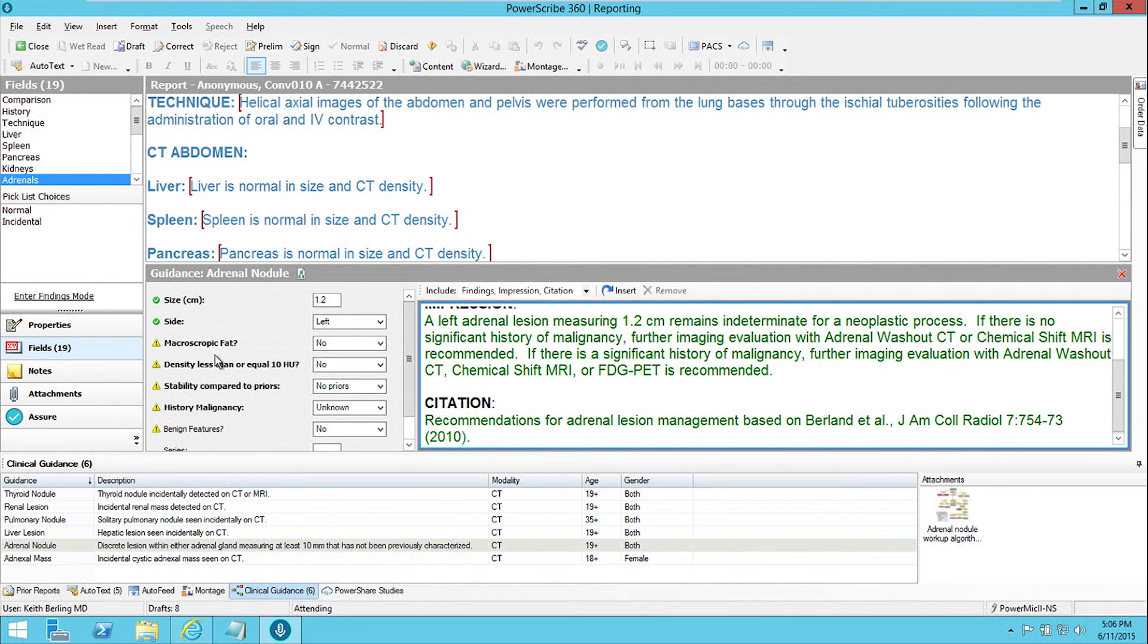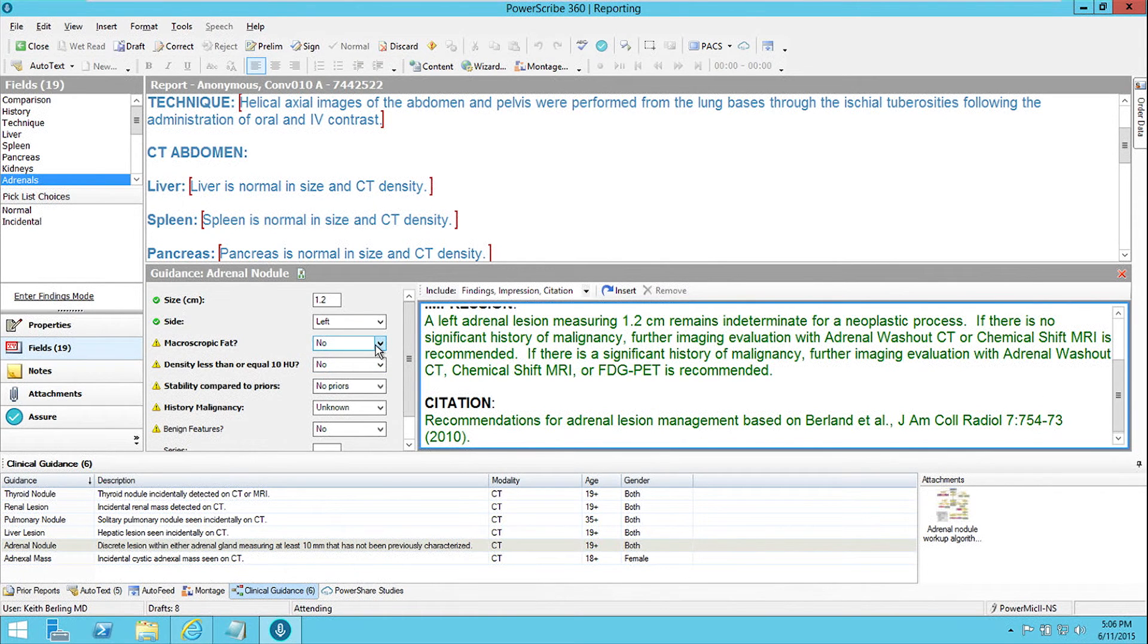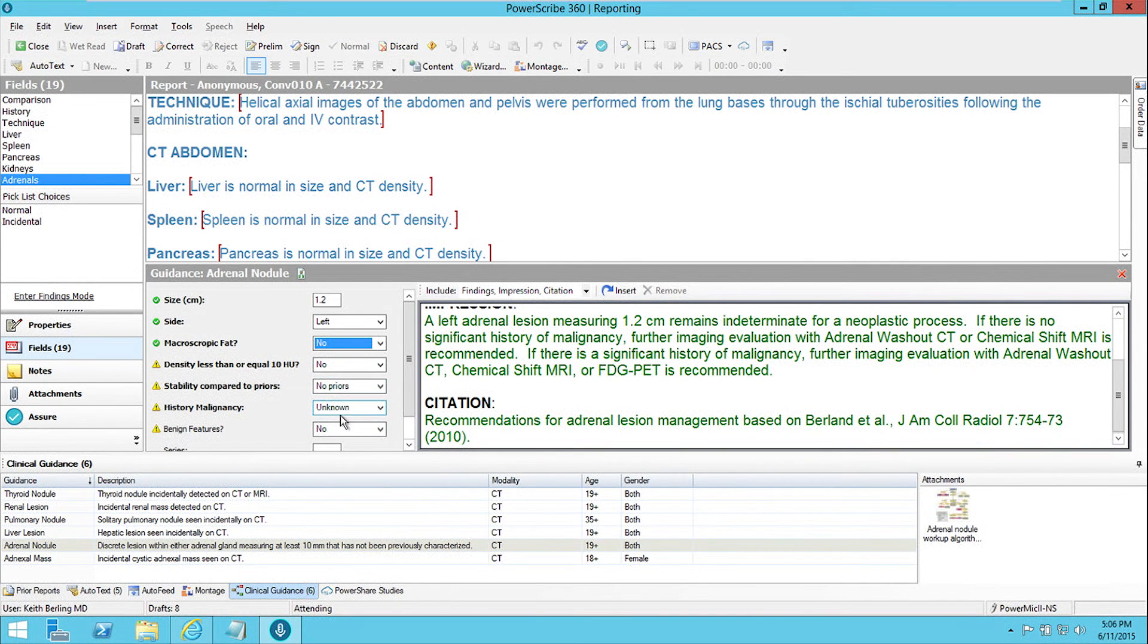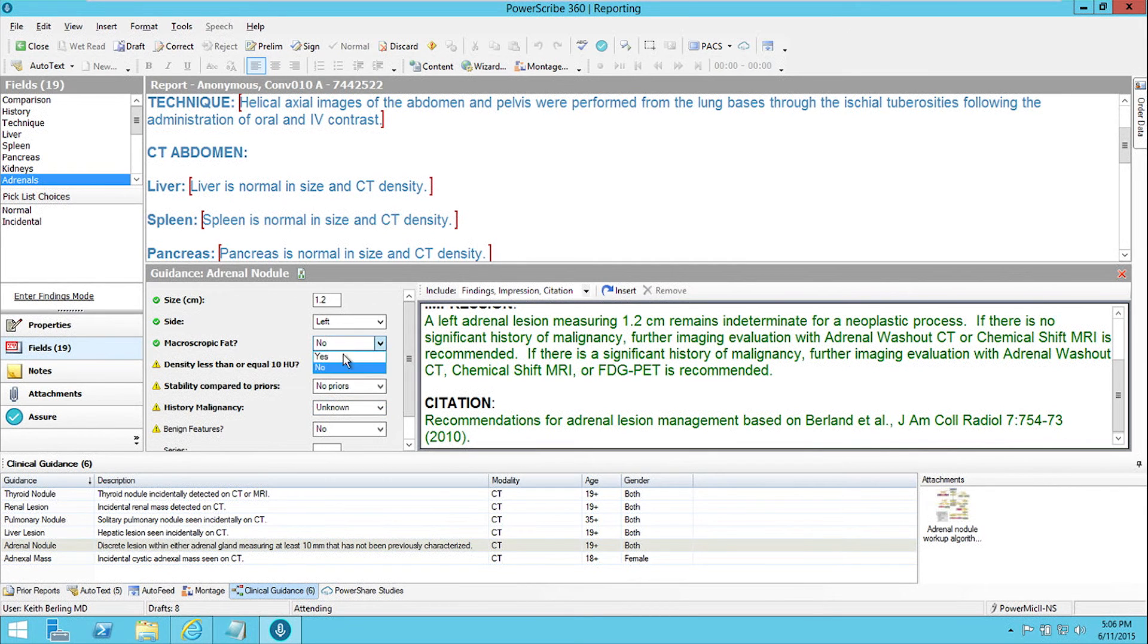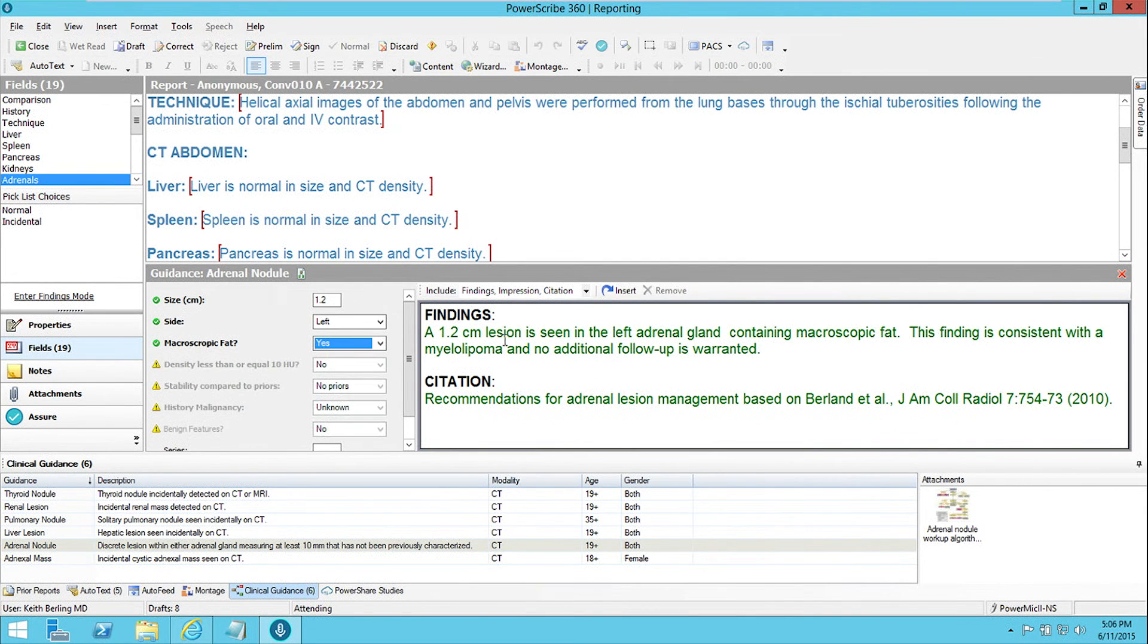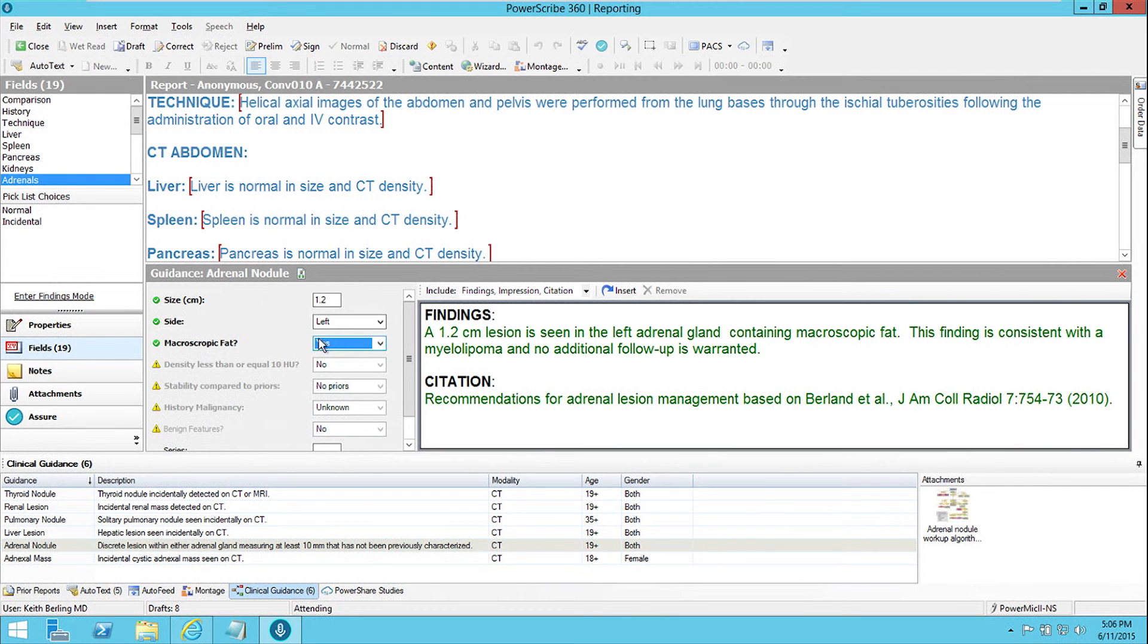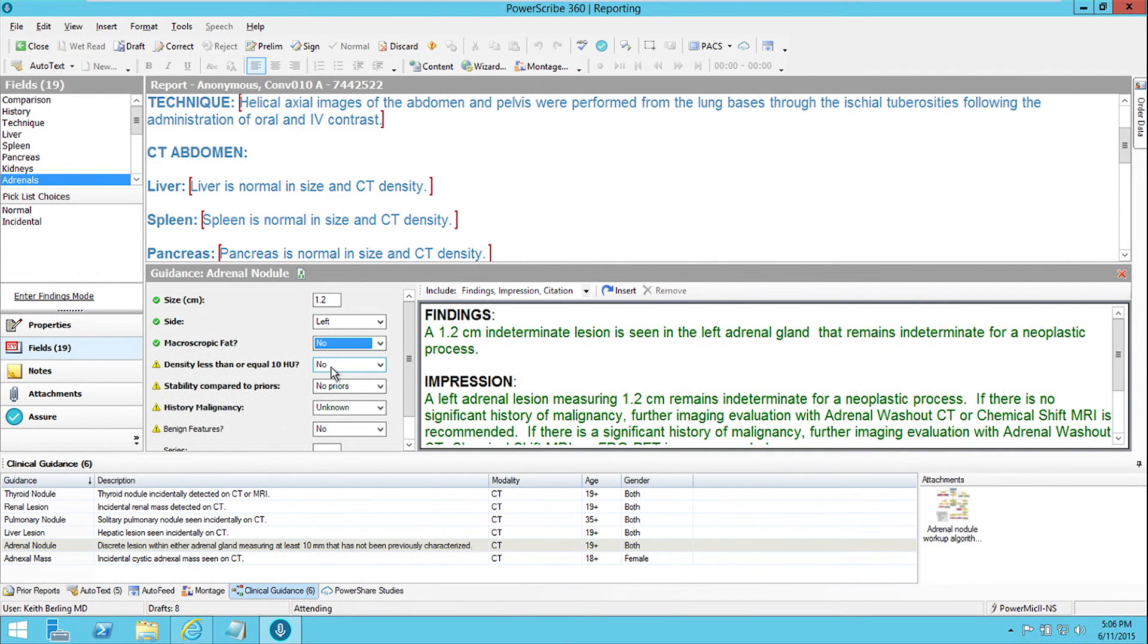There are more questions I could answer about the lesion, whether it has macroscopic fat or not, whether its density is less than 10 Hounsfield units, whether it's stable compared to prior, whether the patient has a history of malignancy. And as I change these, it updates the text that would be inserted into the report. So if we said there was macroscopic fat, it would say that it was consistent with a myelolipoma, and no additional follow-up is warranted. But let's say that we don't see macroscopic fat in this one.